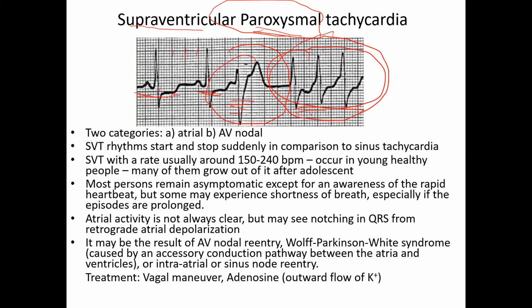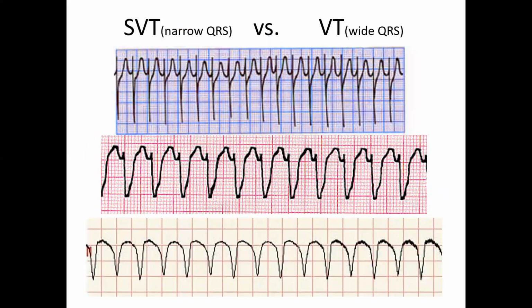So now you can see it's not regular, obviously. If you look at the whole strip, you could see relatively normal. Again, there is ST depression, but QRS is normal, more or less. And then you see the sudden ventricular beat, and then it goes off into tachycardia when it returns. Okay. I wouldn't really look at the one in the middle because that's kind of weird.